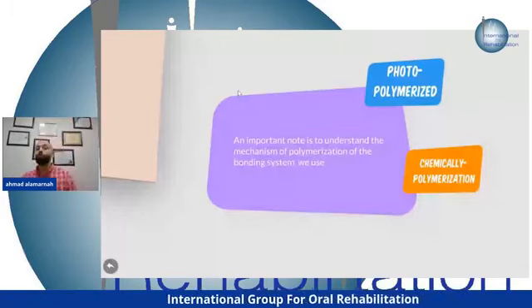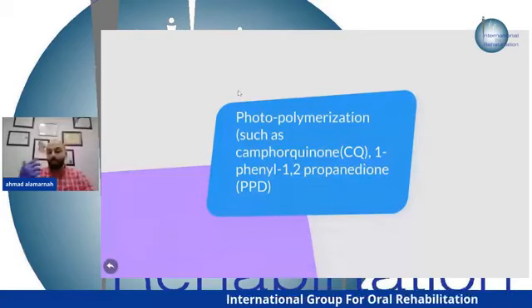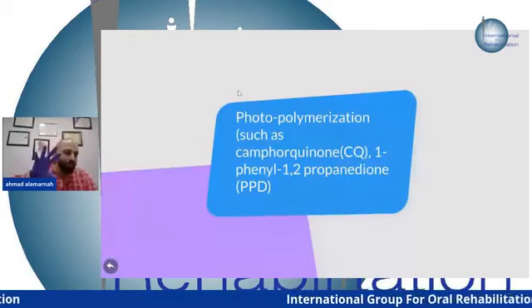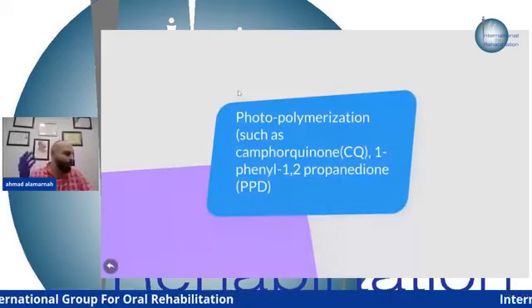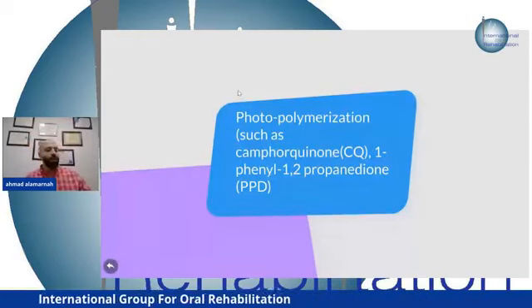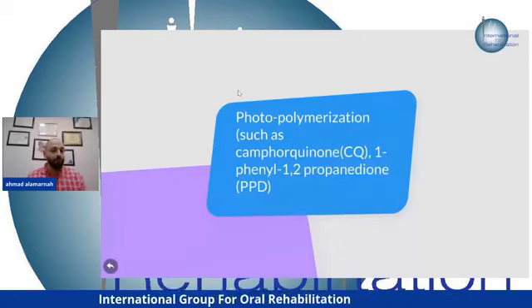For the photopolymerization, we have to know that we have different types of material. We have different types of initiator, such as camphorquinone, the most common, okay, and phenyl propanedione. So there's a difference between them. Camphorquinone works at the blue light, the normal Chinese light cure, like this, okay? It's a blue light, only blue light. But other types of photoinitiator work at the violet light, okay?